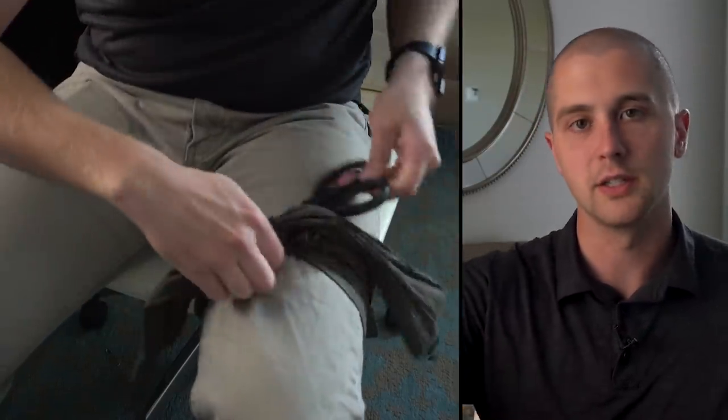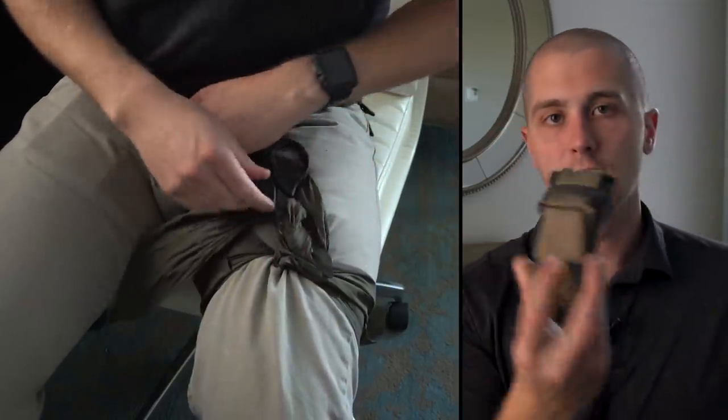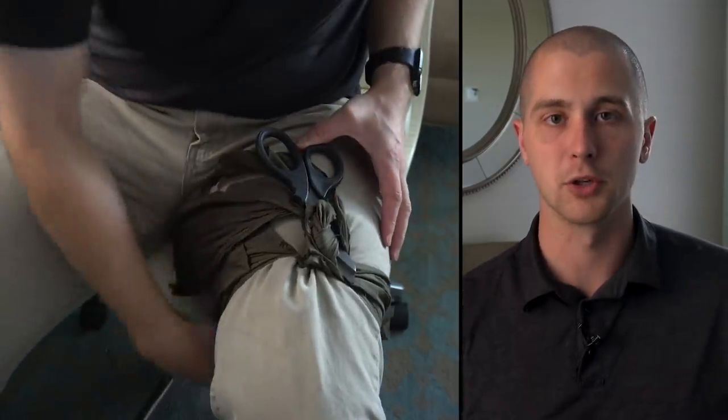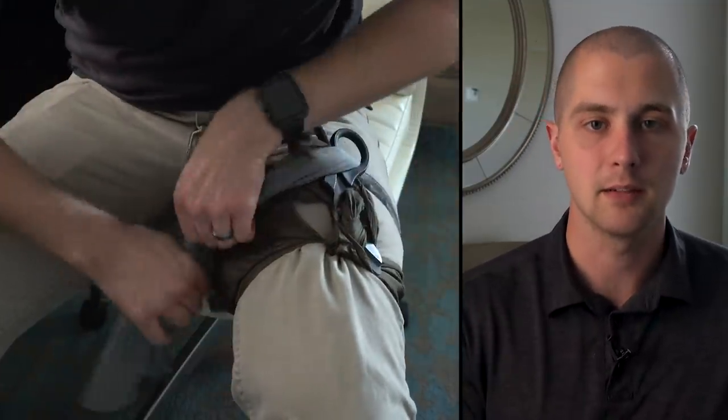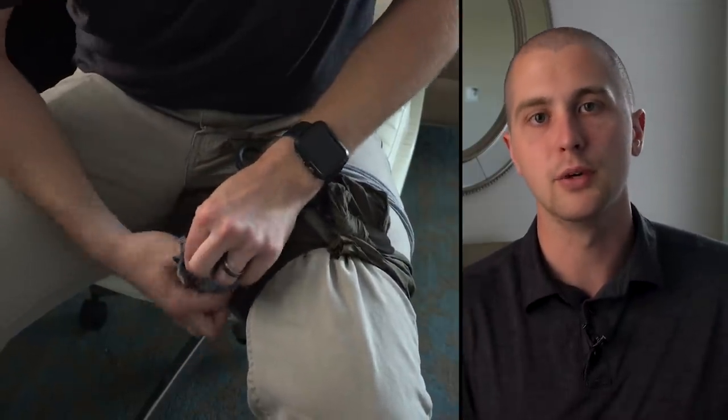Then you're gonna take your makeshift windlass and just start turning it — it's the same concept as a SOFTT-W or another windlass tourniquet you can buy commercially. You're gonna turn that until blood flow stops. At that point, you need to hold that windlass right there. Take the second piece of cloth, put it across and feed it through that windlass, which keeps it from turning back and loosening. Once secure, make sure all blood flow is stopped; if not, try tightening one or two more turns. If that's not working, prepare to put a second tourniquet on. Ideally, I'd actually try to do wound packing first if you can — it's a bit more effective and quicker. It takes time to set up a makeshift tourniquet.